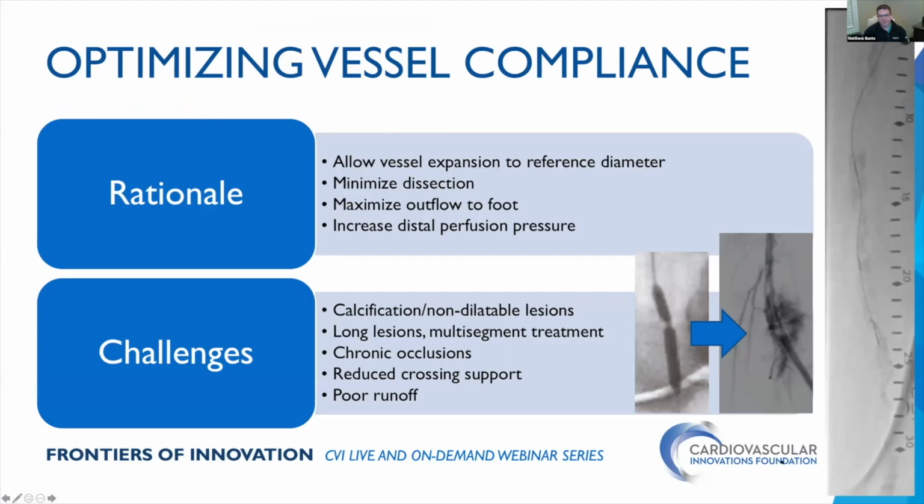I think optimizing vessel compliance is a really important part of what we do, and the rationale for it is obviously it allows for proper vessel expansion so that we can get a final treatment that is going to maximize outflow to the foot and then increase distal perfusion pressure, but also minimize dissection.